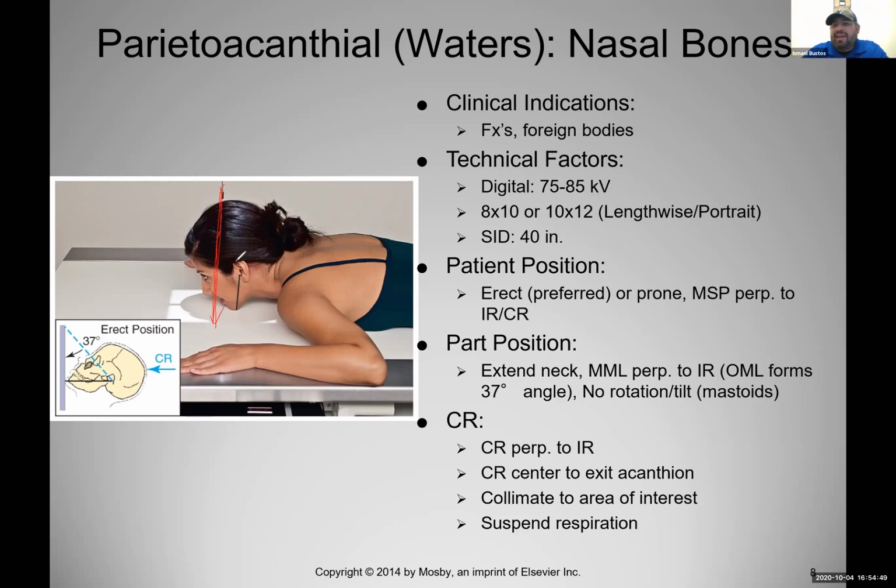It's a parietoacanthial projection. So again, it tells you which way the beam is traveling. It's entering the parietal bone, which is in the back, and exiting the acanthion, which is down there. Once you've done that, suspend respiration and make the exposure.